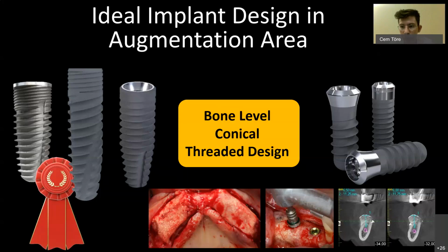Also, another thing we should warn about is something we do to ensure primary stability in the regular bone, which is sometimes under preparation, which is not using the final drill or not fully using the final drill, not going all the way with it. If you take this route in an augmented bone, you have a very real chance of cracking the bone you have augmented or separating the bone you have augmented from the native bone in the area. So we must use the final burr, but we should refrain from under preparations in the augmented bone.